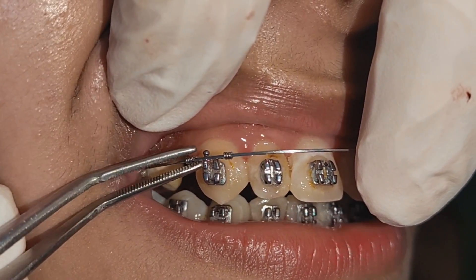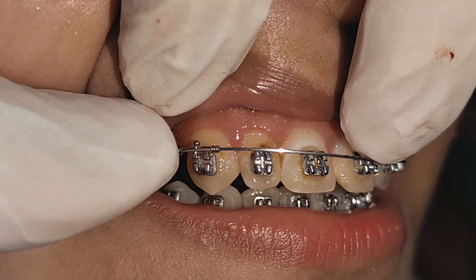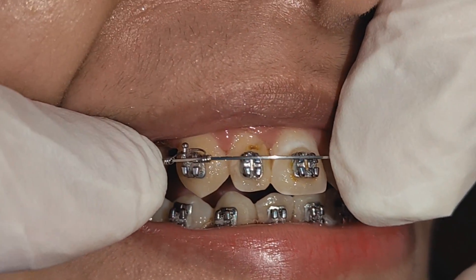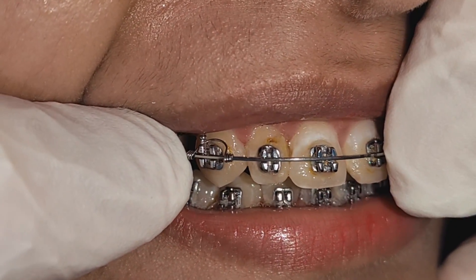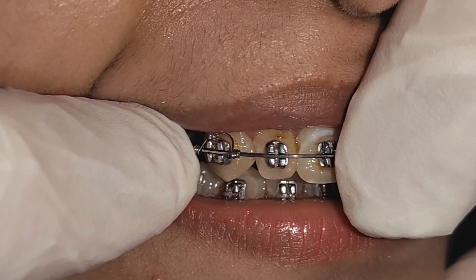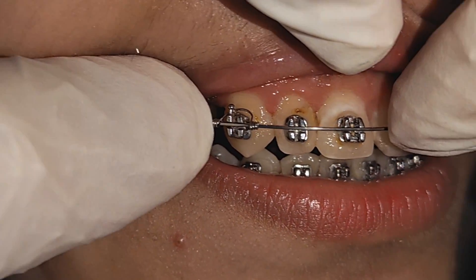This is the way you activate the torque spring to move the root inside. As you can see, the spring is directed toward the root. That is the way to move the root inside to obtain more positive torque.